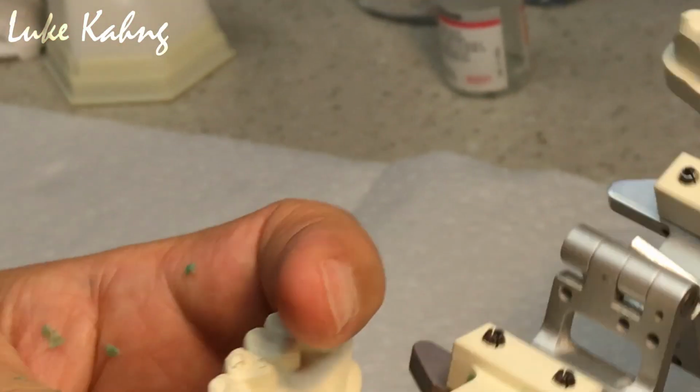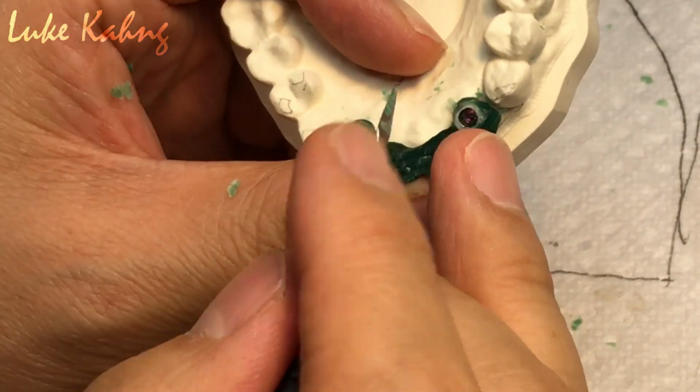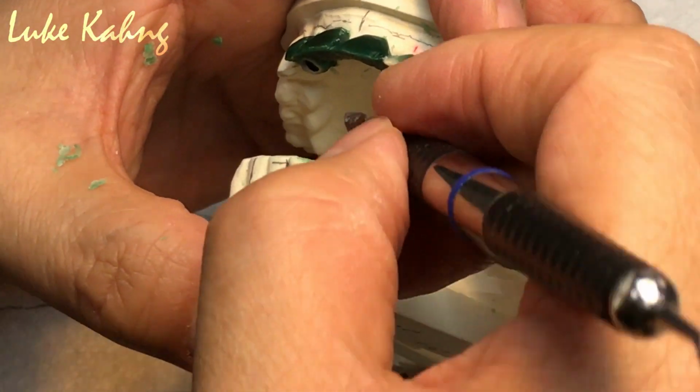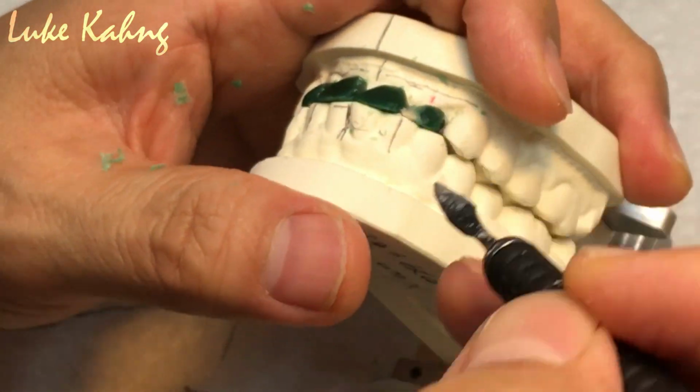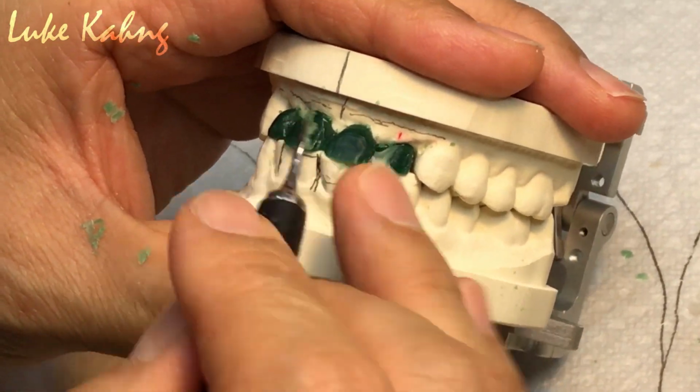Now you don't need this filling. It will be open. Why? Because of the bite. Yeah. See, it is open. That's good. Why? Here is under. So you don't have to make the perfect one. Now, good. Now, midline, make U shape.